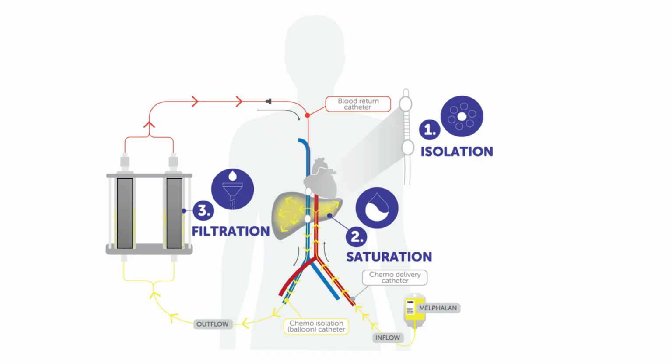And that will avoid having any systemic effects and complications from it. The anesthesia provider will also have access to the left-sided femoral artery blood pressure monitoring, and that's usually where the arterial blood pressure is being measured.